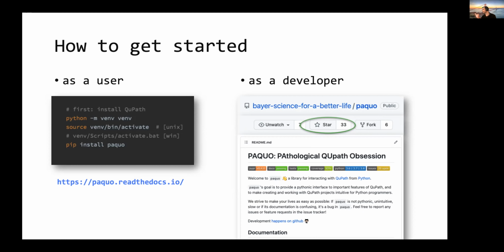I think we already tweaked it a little bit in one GitHub issue where we improved the handling speed by not updating the QuPath project every time. We haven't used it for writing millions of detection objects in a project yet. But if there are any performance issues, open an issue and we'll look into it.